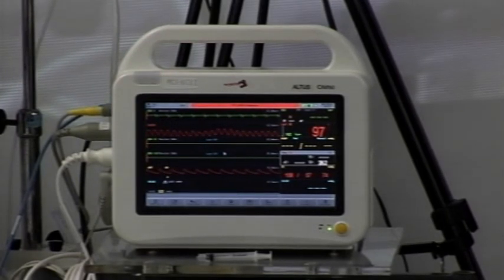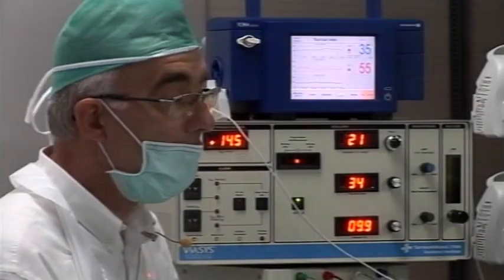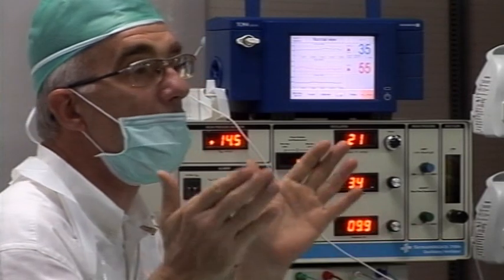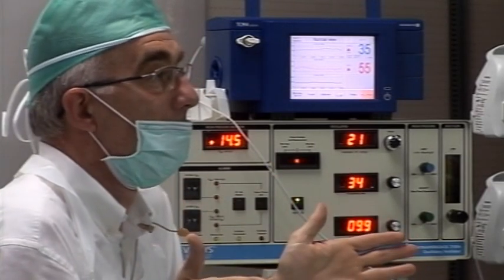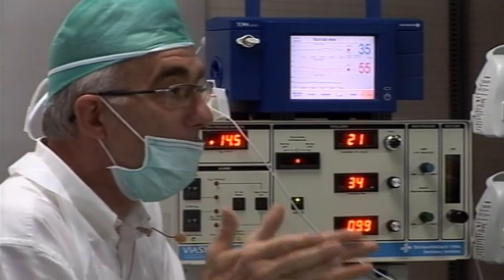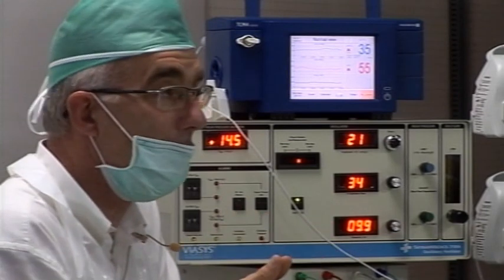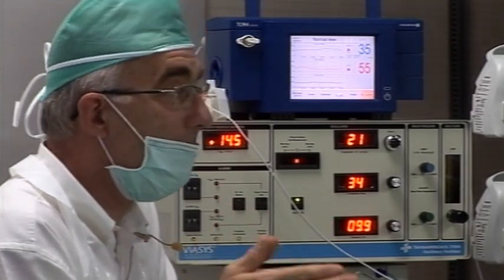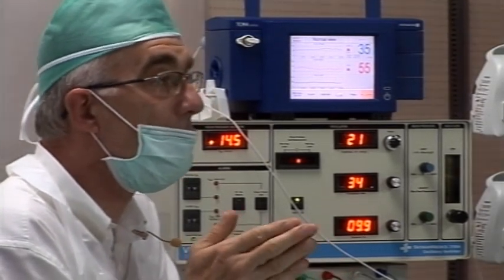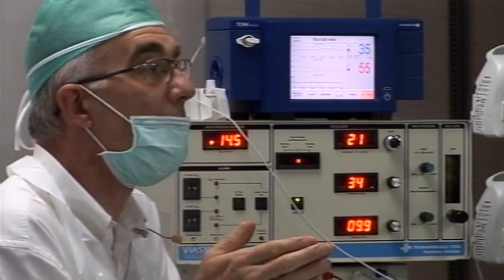Even at a low level of CDP, you may overdistend with a CDP of 7. I didn't show you this example, that's too bad. And the highest CDP we used was in a PREM, 28 weeker, 1,000 gram, severe RDS, 3 doses of surfactant. The highest CDP we used was 33.